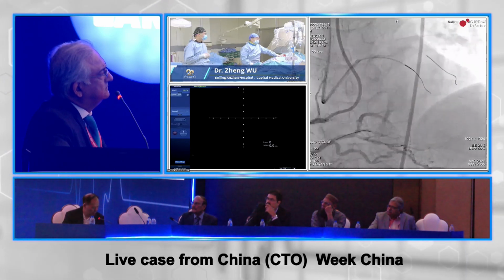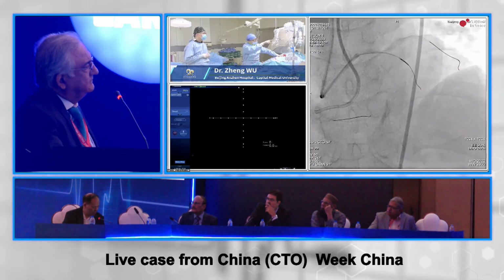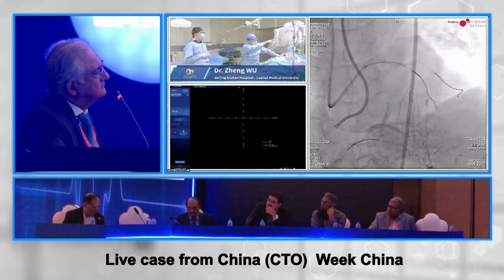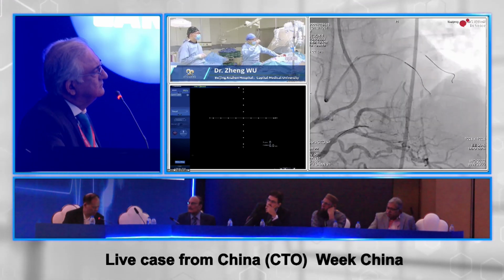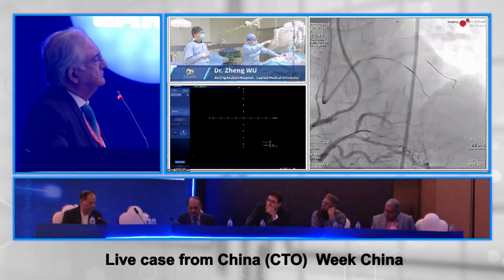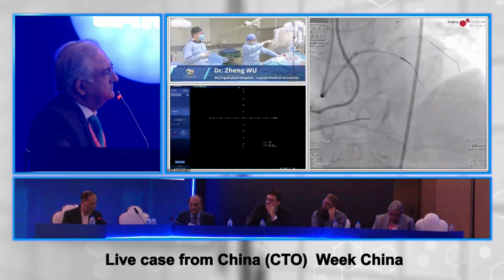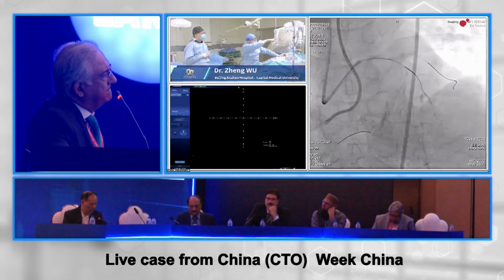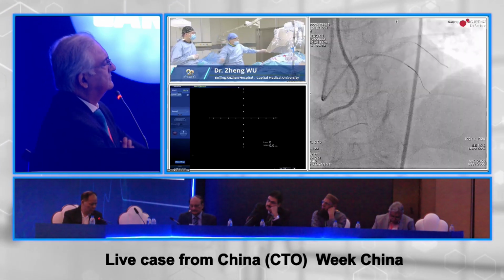Yeah, I think you gave me a good suggestion, but I meet resistance because of the calcification just here. Even if I use a small balloon to predilate and use a low profile microcatheter, they all cannot cross the lesion here. All the devices cannot reach the level of the distal bifurcation. You can see there is much resistance here.